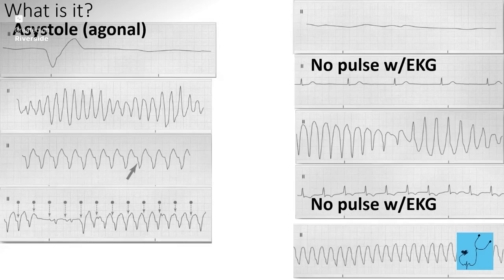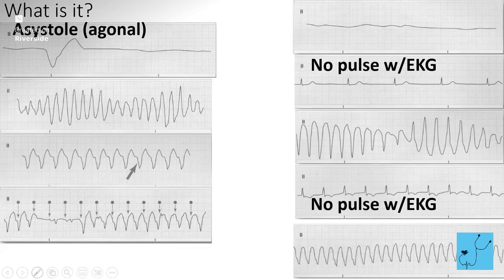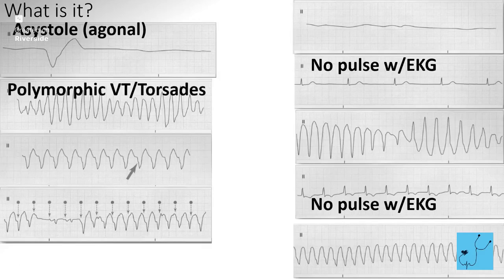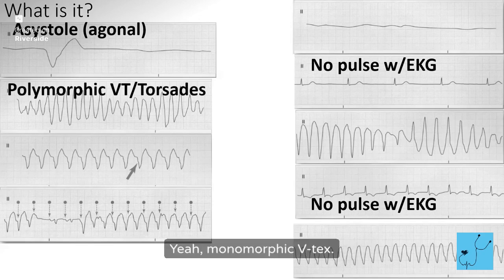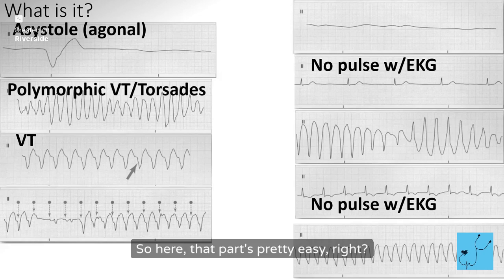Okay. What about this one? Torsades. Yeah, definitely. So it's small and then big and small and big. Or polymorphic VTAC. What about this one? Yeah, monomorphic VTAC. So here, that part's pretty easy, right? That looks just like this.